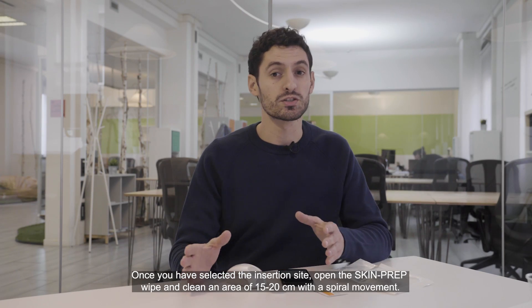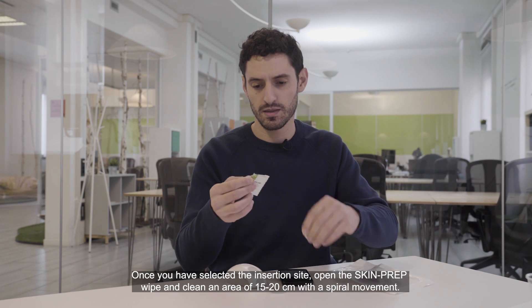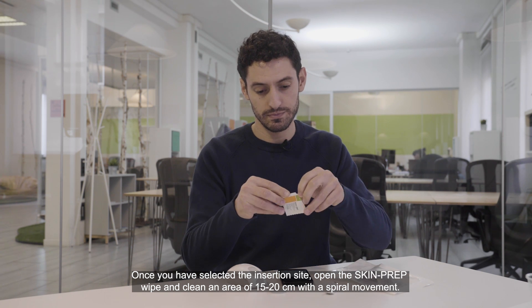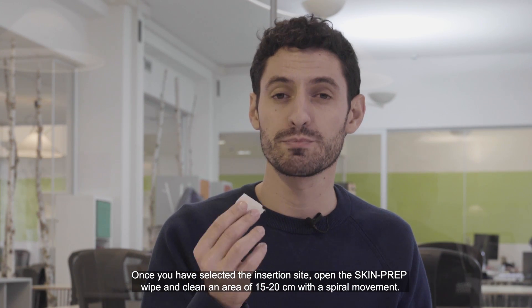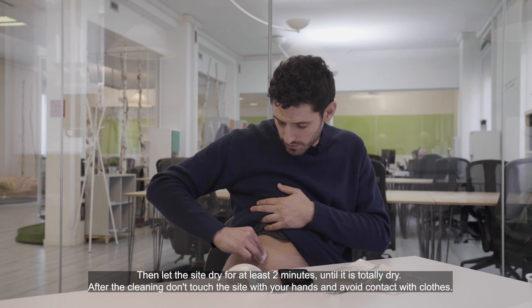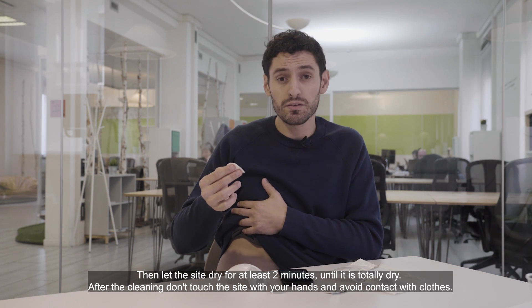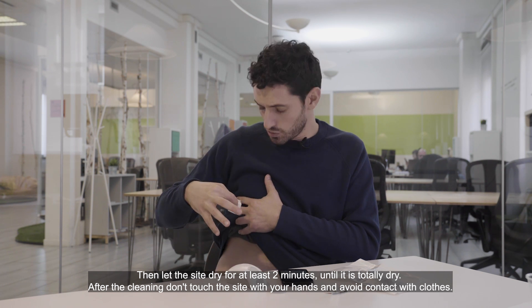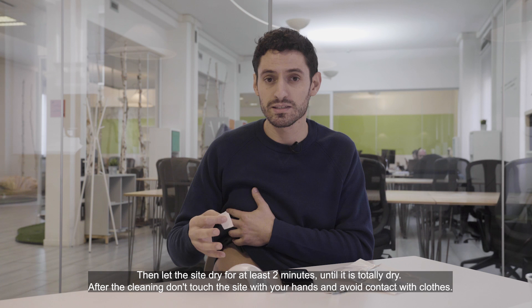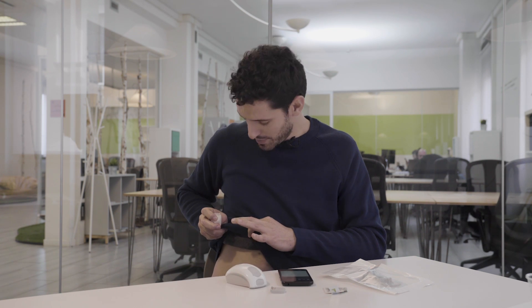Once you have selected the insertion site, open the skin prep wipe and clean an area of 15 to 20 centimeters with a spiral movement. Then let the site dry for at least two minutes until it is totally dry. After cleaning, don't touch the site with your hands and avoid contact with clothes.